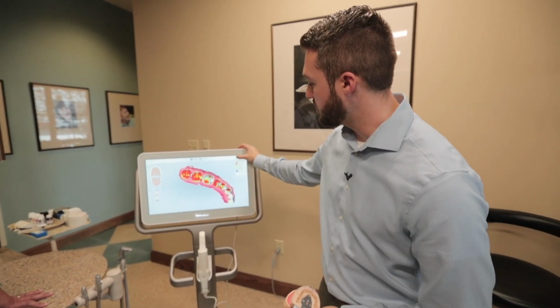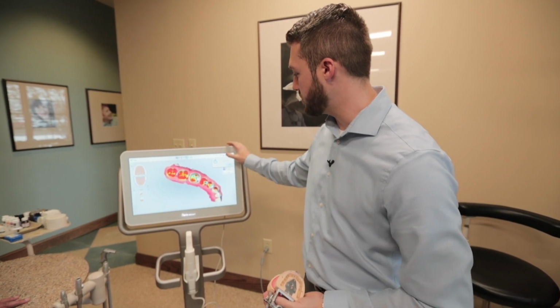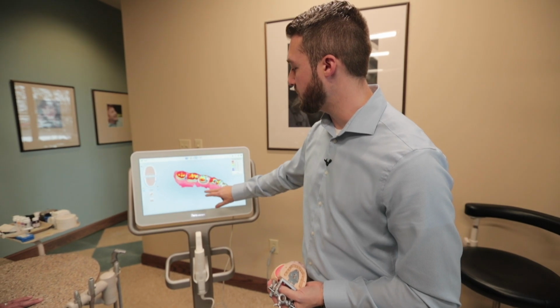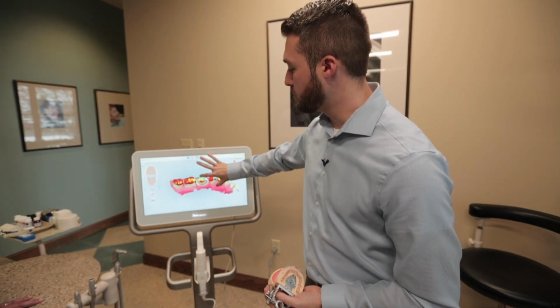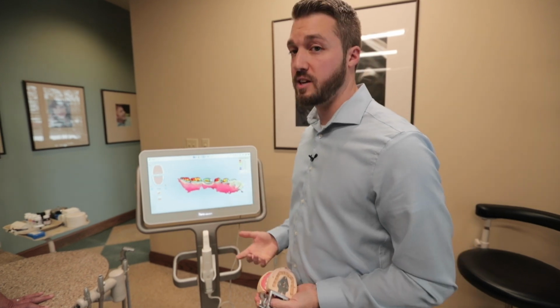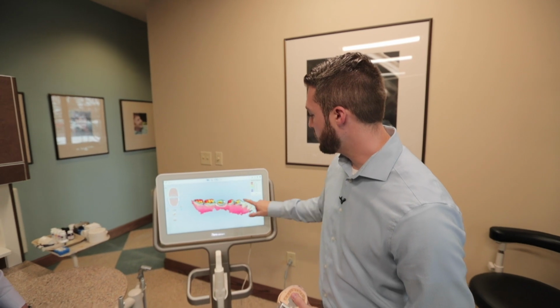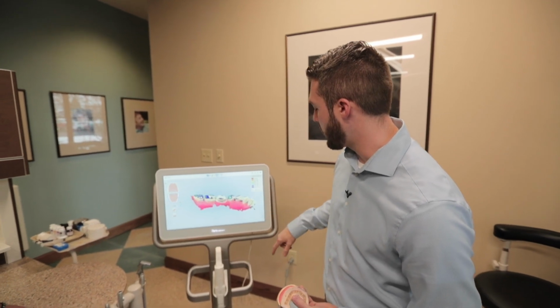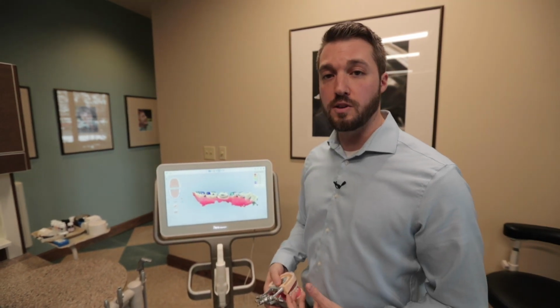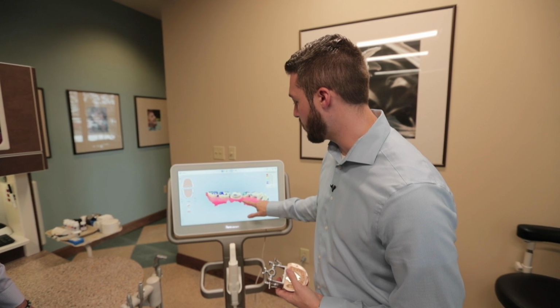We have a nice little clock setting on here that tells us how long it took us to scan, 4 minutes, 38 seconds. But what I really love about the scanner is we use a tool here that's very similar to our occlusalgram, right? It looks like it, but it's not. It's called occlusal clearance, and it's exactly what it says. It's the clearance that we have for our occlusal. So we know here, looking at our guide, we can change the scale to any scale that we want, and we can see if we have enough room or enough reduction for the material of choice, all right? So if we do have to go in here and reduce a little bit more, we have that ability.